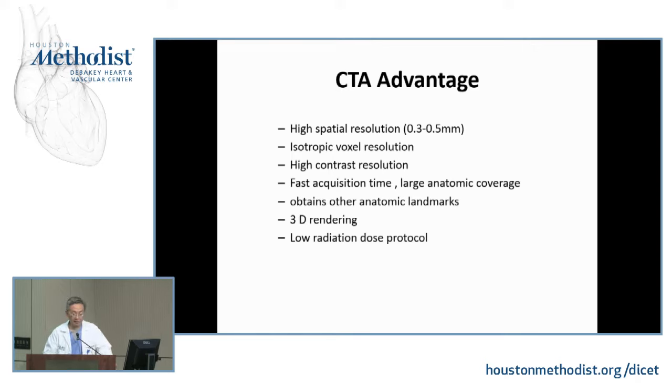Okay, and the main advantage, I think this is mainly a summary of what Dr. Nabi showed in his introductory talk. All this technical quality of CTA makes it really the go-to technology for assessment of coronary disease. Okay.